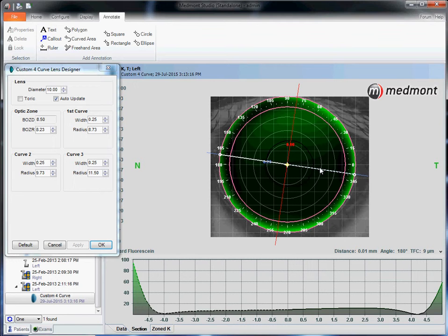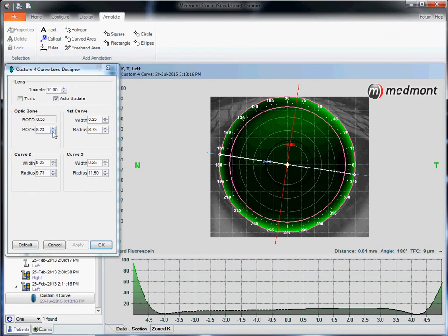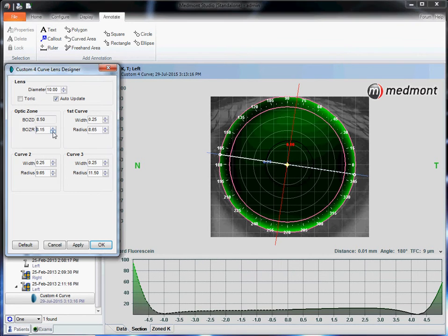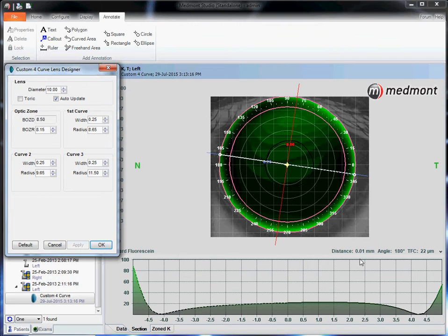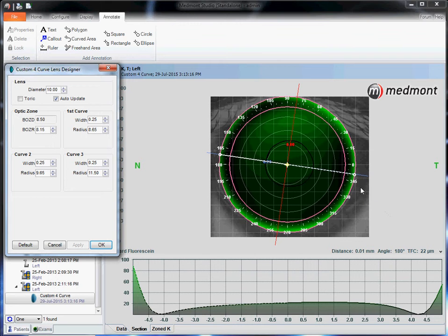To see fluorescein molecules we must have 20 microns of fluid between lens and cornea. With 9 microns our lens is effectively too flat. It will appear as touch through the slit lamp. So let's steepen the base curve a couple steps, take ourselves up to about 20 microns. Now we're at 22. This is good for apical clearance.